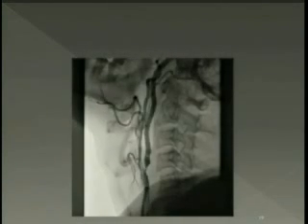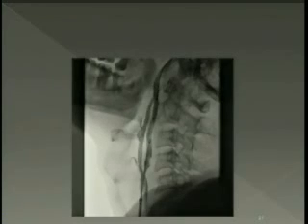Michelle, are you using all guides for carotids? Always guided there. So a fairly simple lesion. This is an Angioguard, 7 millimeters, going through the narrowing. Then the direct stent. You can see the stent in position. Most of the time, we like to do direct stenting.